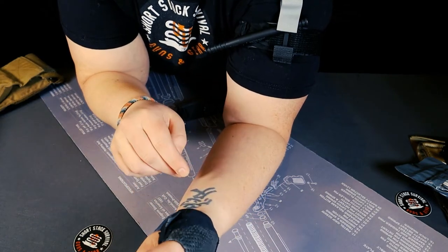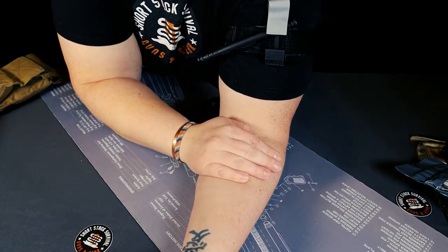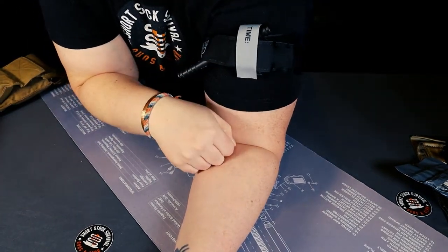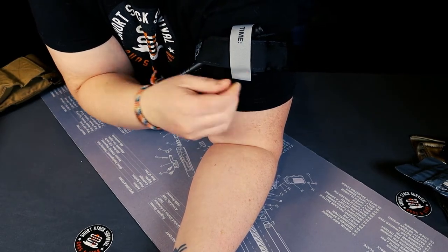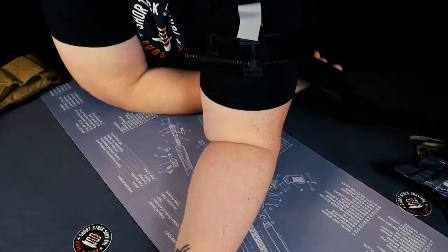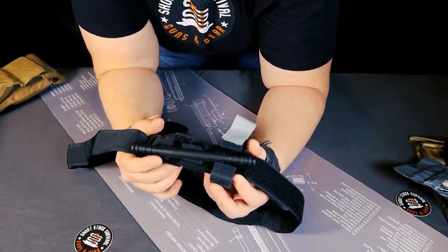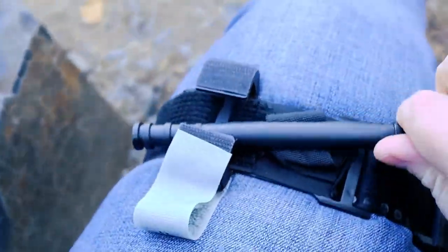There's no blood flow through my arm. By putting this high and tight, I've stopped the blood flow and I shouldn't bleed out. When you're done, wrap this around the arm and put this over and write the time down. That way the medical staff can know when this tourniquet was applied. Do not take it off until you're in a facility that can properly take care of that person. It's perfectly acceptable to practice applying a tourniquet to yourself — I can feel the blood coming back into my arm, it feels kind of tingly, just like you slept on it.